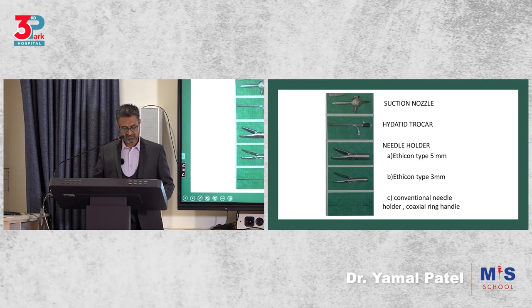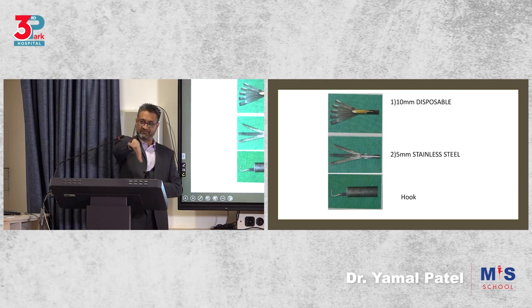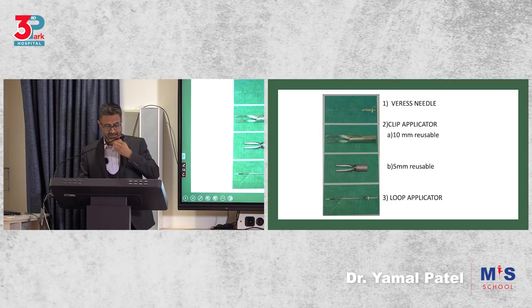We move on further. These are suction and etc. So these are just examples. We have retractors, fan retractors for the liver sometimes that we would use, a hook monopolar or a spatula. And then we have the Veress and the clip applicators.